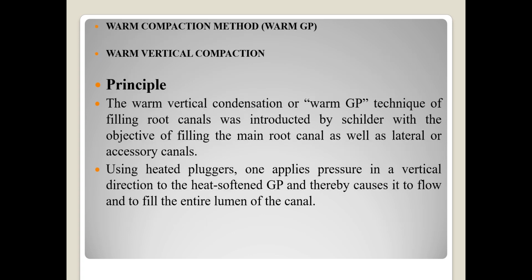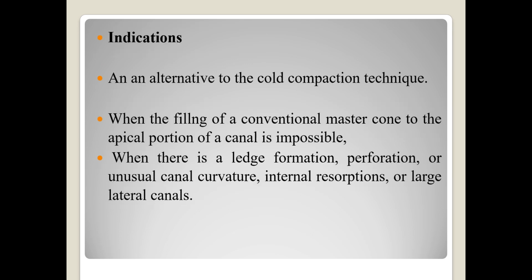Warm compaction method, warm GP, warm vertical compaction. Coming on to the principle, the warm vertical condensation or warm GP technique of filling root canals was introduced by Schilder with the objective of filling the main root canal as well as lateral or accessory canals. Using heat pluggers, one applies pressure in a vertical direction to the heat-softened GP and thereby causes it to flow and to fill the entire lumen of the canal.